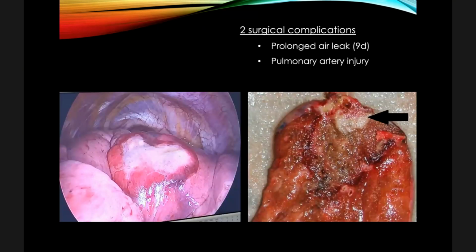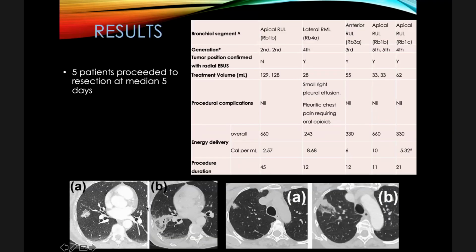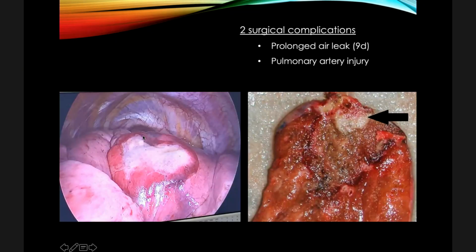Here are some intraoperative and gross histologic images. The image on the left is a thoracoscopic image of the right middle lobe deflated here in the middle with a significant area of pleural blanching over the pleura. And this, in fact, is the patient on the left here. So you can see this area here is the area that demonstrates the pleural blanching on thoracoscopic imaging. However, the overlying parietal pleura was unaffected.